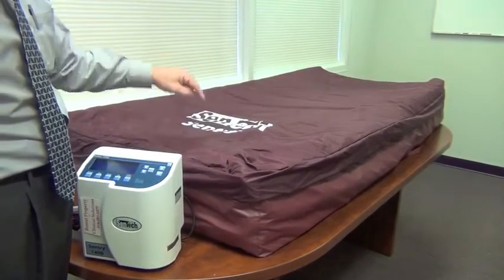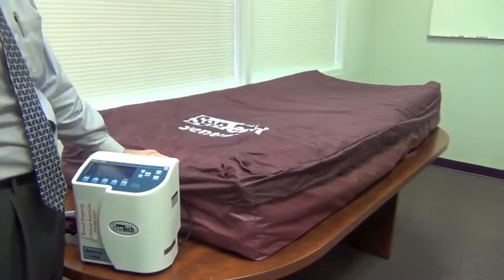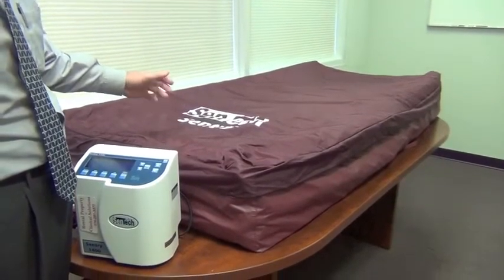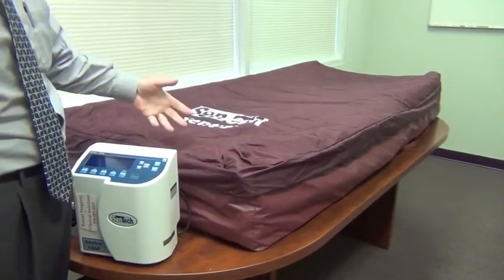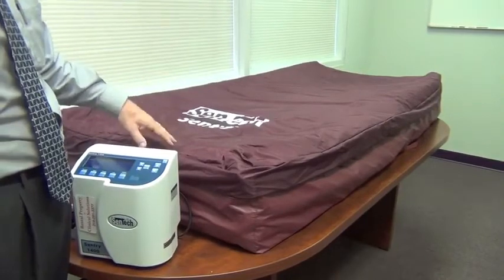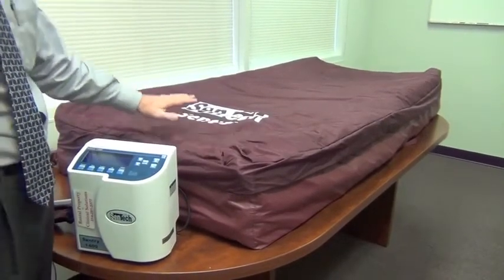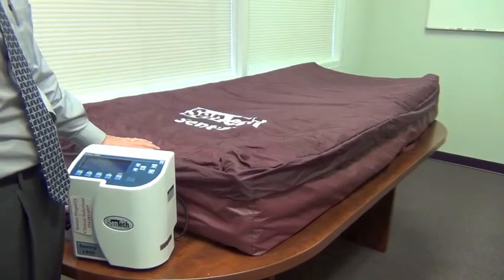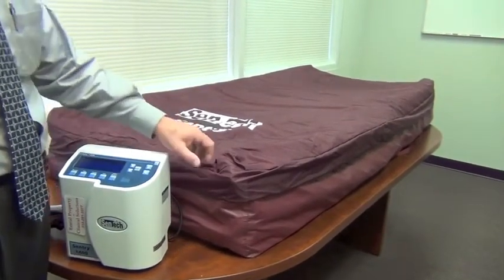With that understanding, we also want to get the patient as close to this material as possible. So if you're padding the bed for incontinence purposes or you need a draw sheet for positioning, keep in mind that ideally the patient rests in contact with this material as much as practical, as much as possible, to realize the full benefit.